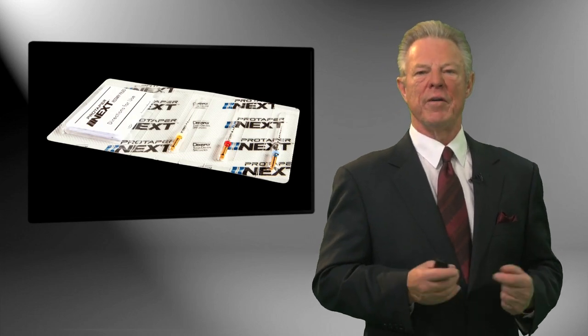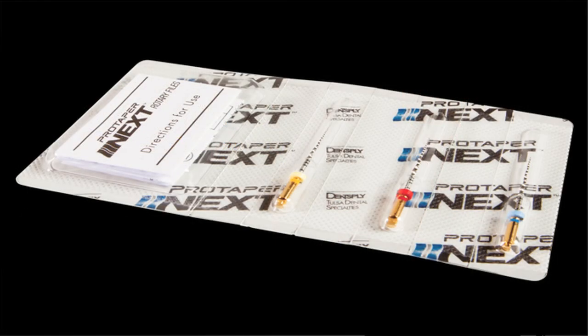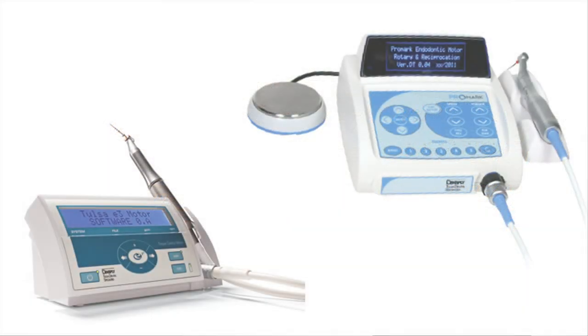Simply an image of a package of ProTaper Next X1, X2, and X3s, and that's where I would start, with X1, 2, and 3s, and I'll tell you how maybe you can integrate this into your practice and test it out. Motors are dedicated to the ProTaper Next. These are wonderful instruments. The E3 on the left and the ProMark on the right. ProMark has a little bit more range and torque to fit the file, so they're very effective that way.